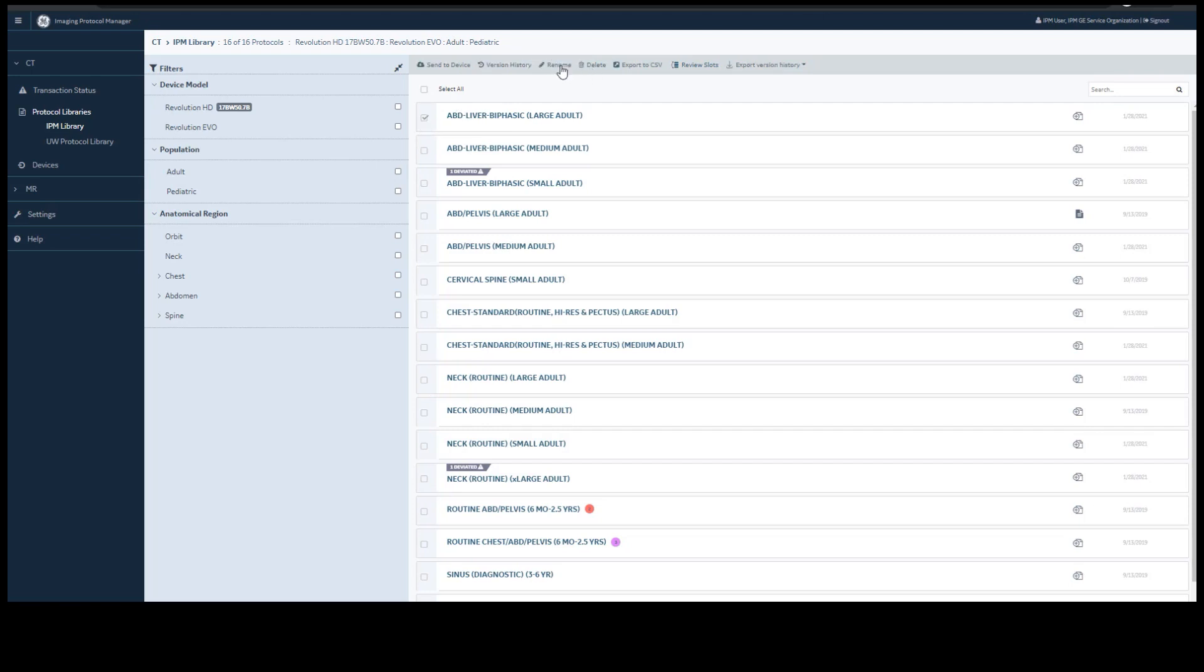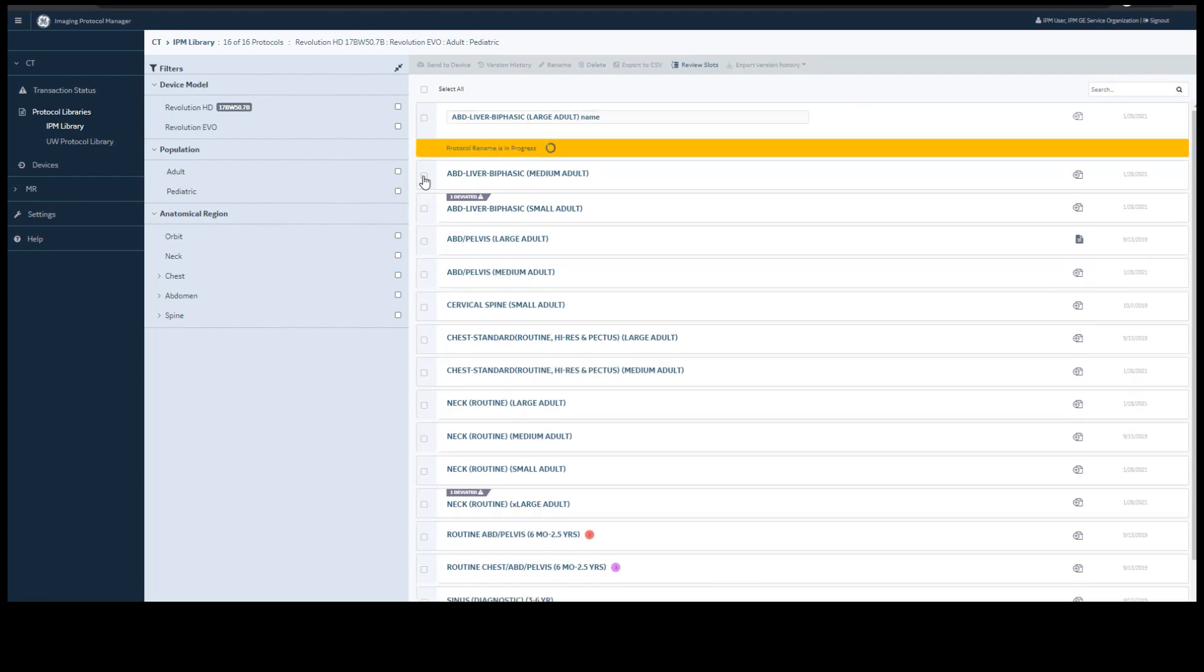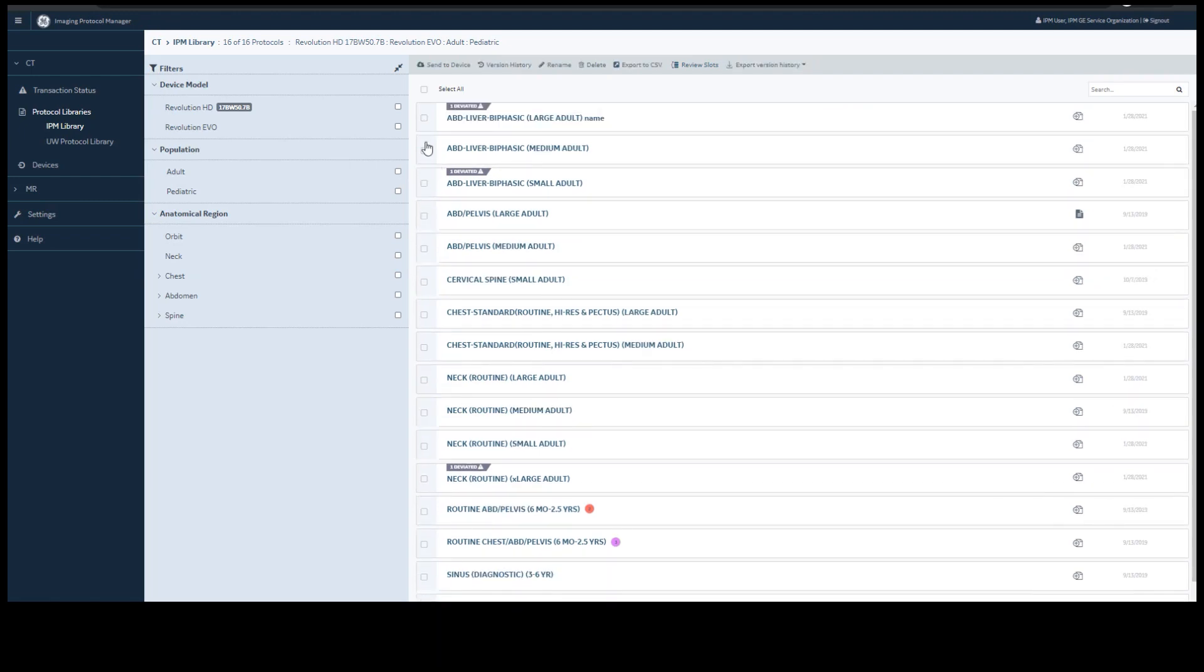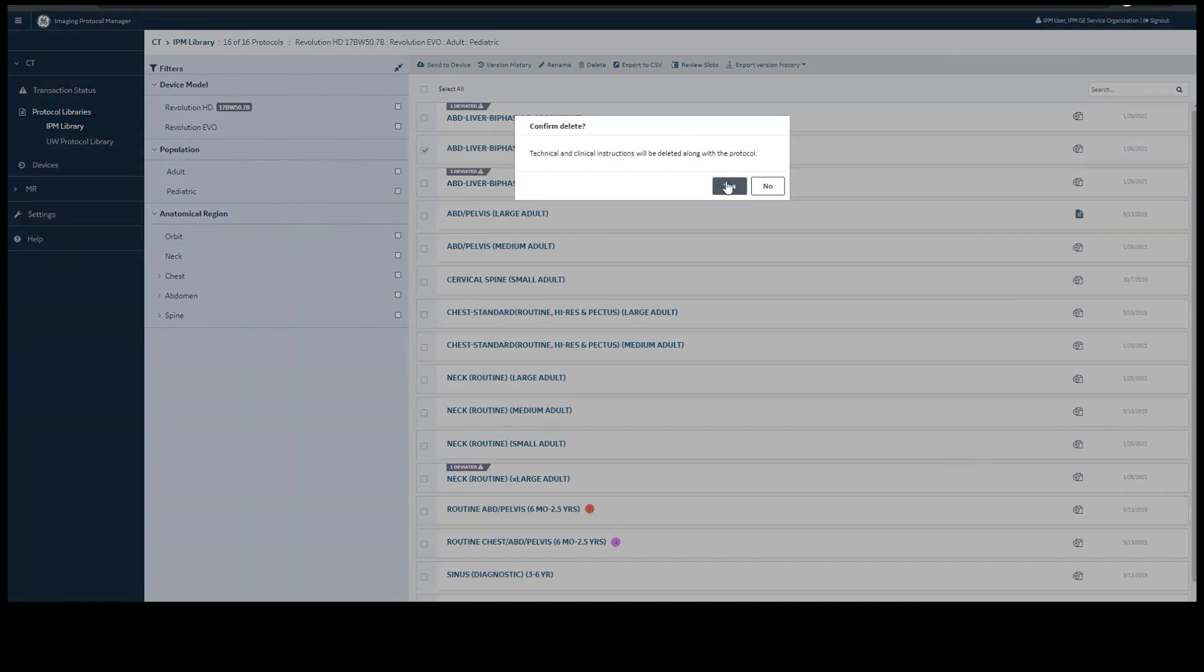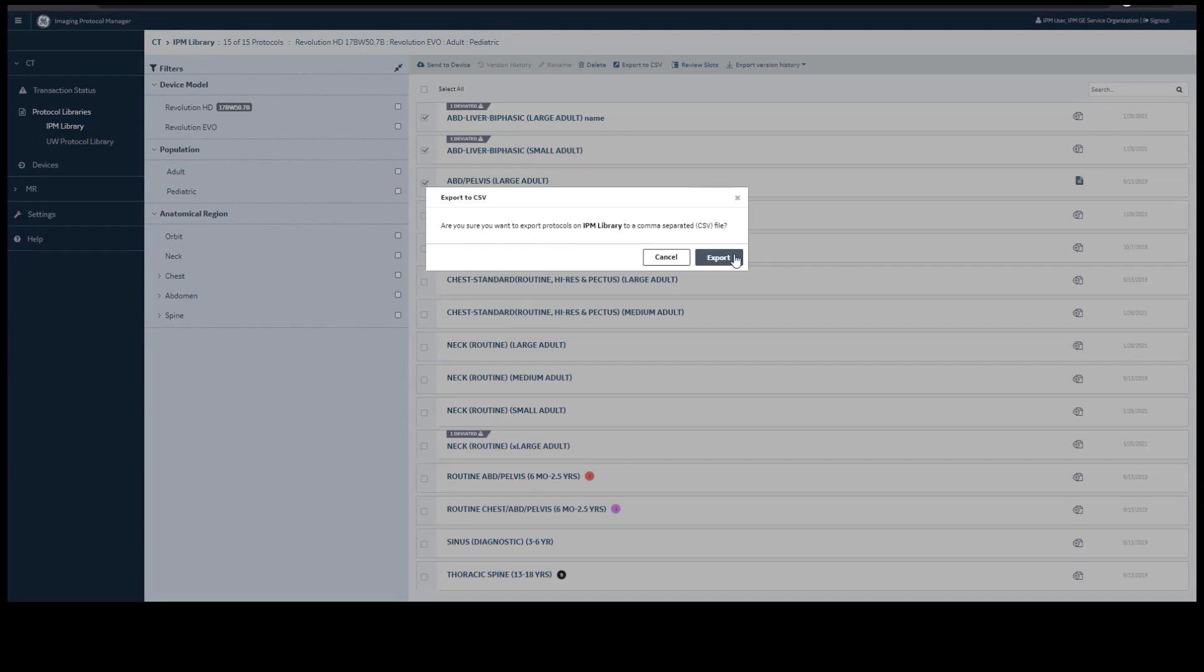You have the option to rename and delete a protocol. To rename, it's as simple as giving it a new name and pressing save. To delete, select a protocol, select delete, and it will be deleted from your standard library only. You have the option to export your protocols.